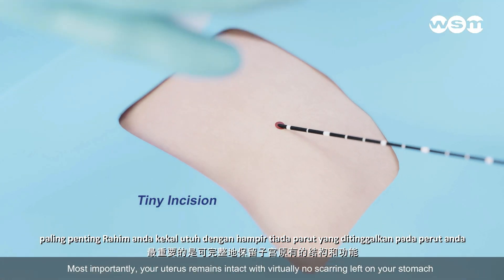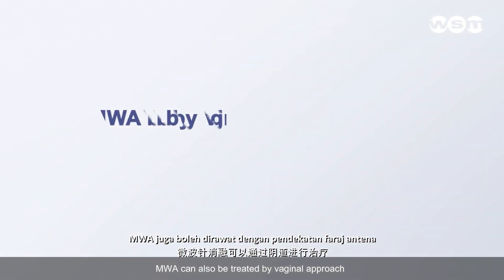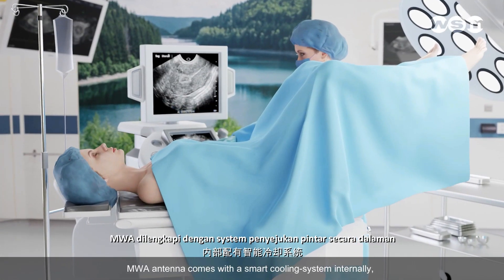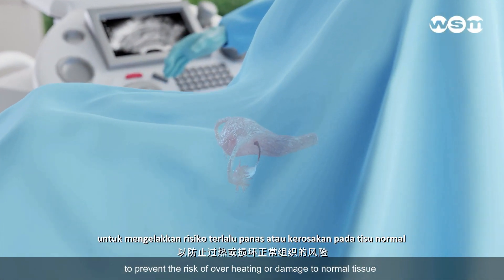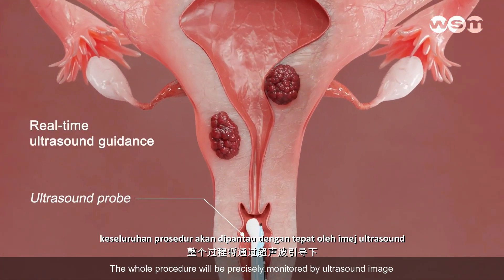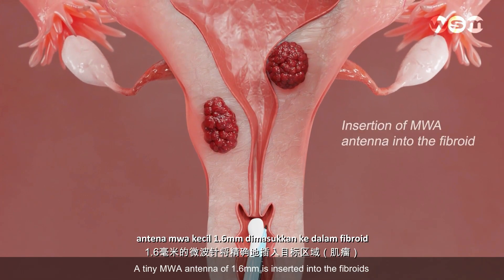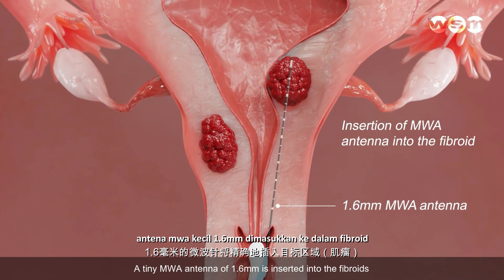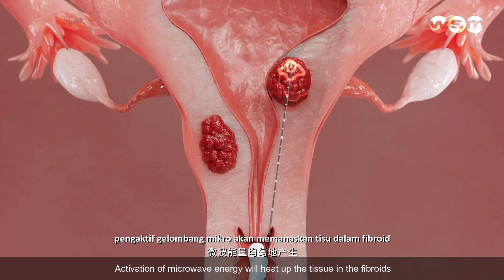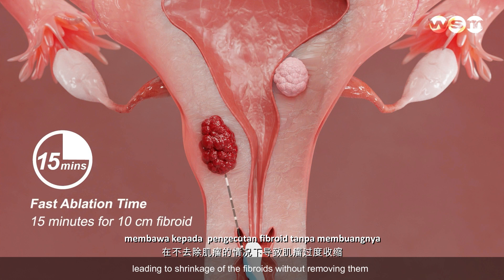Most importantly, your uterus remains intact with virtually no scarring left on your stomach. MWA can also be performed by vaginal approach. The MWA antenna comes with a smart cooling system internally to prevent the risk of overheating or damage to normal tissue. The whole procedure is precisely monitored by ultrasound imaging. A tiny MWA antenna of 1.6 mm is inserted into the fibroids. Activation of microwave energy heats up the tissue in the fibroids, causing the fibroid tissue to die, leading to shrinkage of the fibroids without removing them.